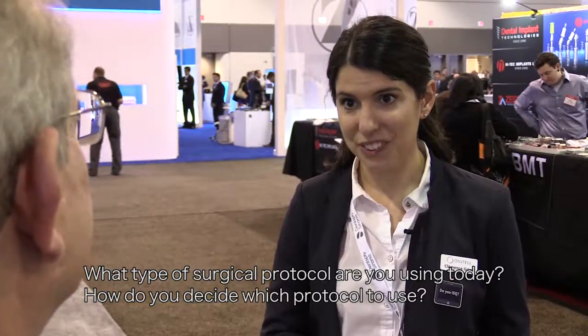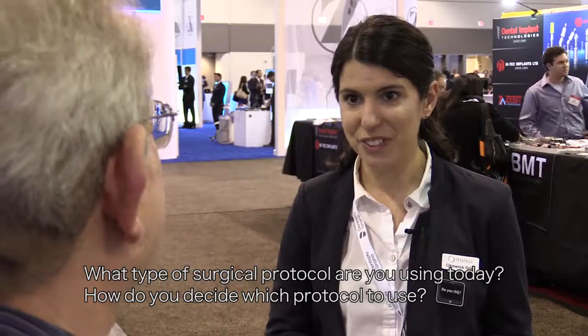What type of surgical protocol do you use today, and how do you decide which protocol to use? The surgical protocol that I use in my practice is based upon the individual needs of the patient. The way that I diagnose and treatment plan each individual patient is usually through the use of 3D imaging. So we base everything on a cone beam CT evaluation. We can understand, at least preliminarily, the shape and the size of the bone, the density of the bone, and we can then plan with interactive treatment planning software the angulation and trajectory of the implant to best restore the patient to function and aesthetics.